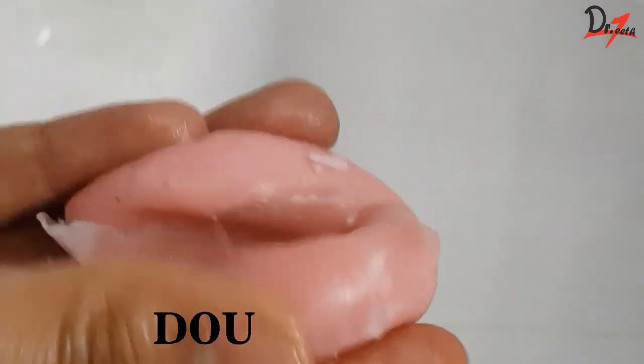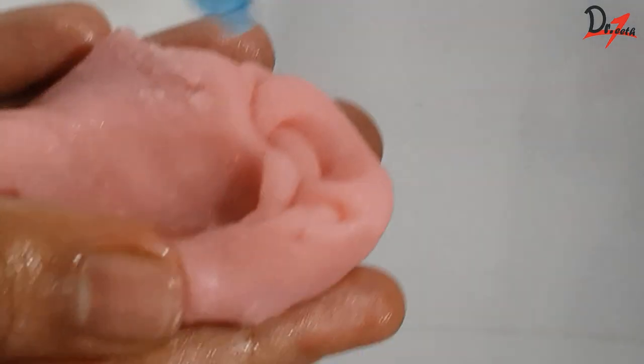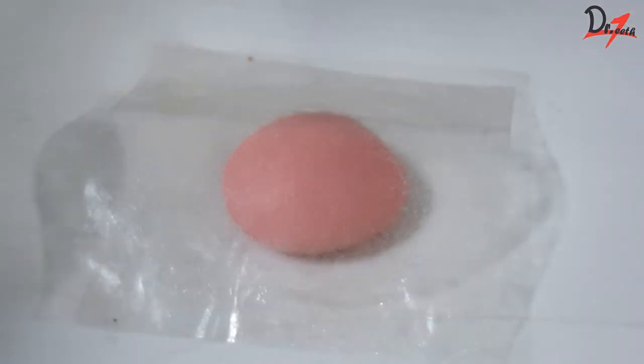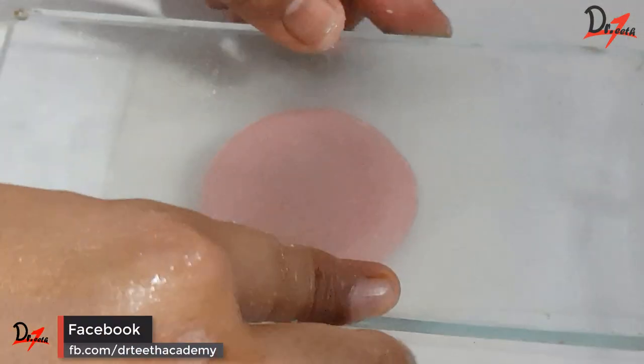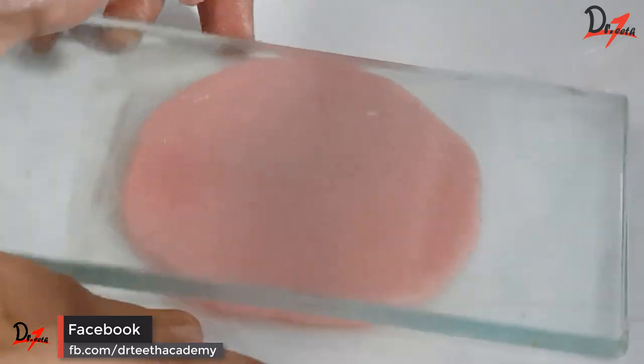The next stage is the dough stage, as you can see here. The material becomes less glossy and it can be easily manipulated — it doesn't stick. So we will roll it into a ball, then place it in between the two cellophane sheets and press it using a glass slab to get around 2mm of thickness.